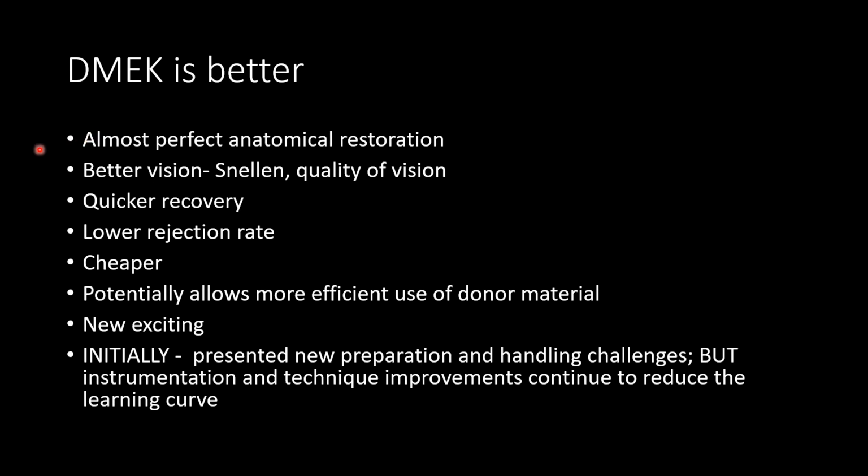You're restoring the patient's anatomy, the patients see better, they get there more quickly, they have a lower risk of rejection. Doing a DMEK is cheaper, and sometimes it allows you to do more with the same material.